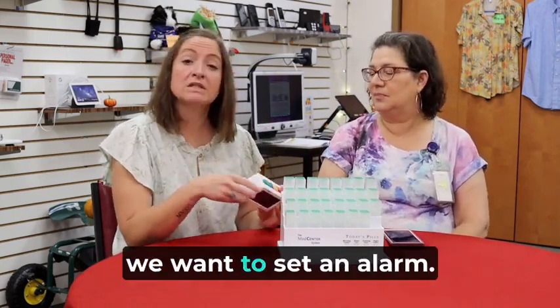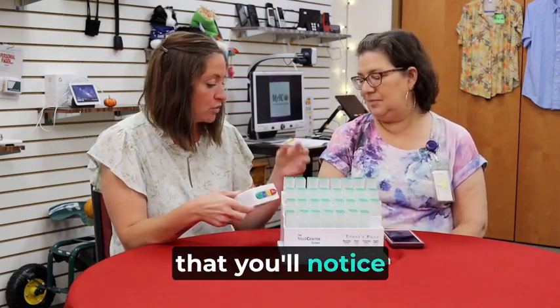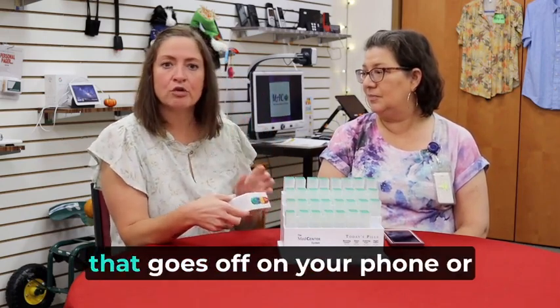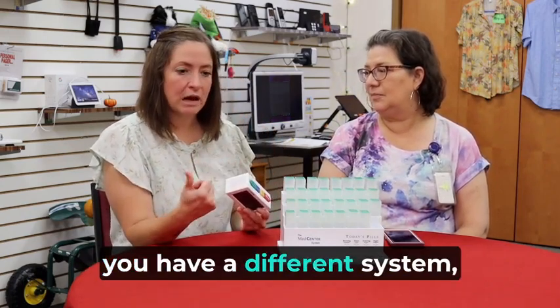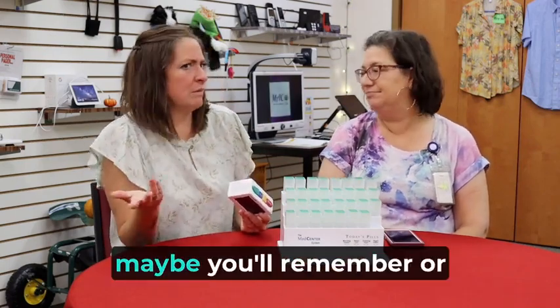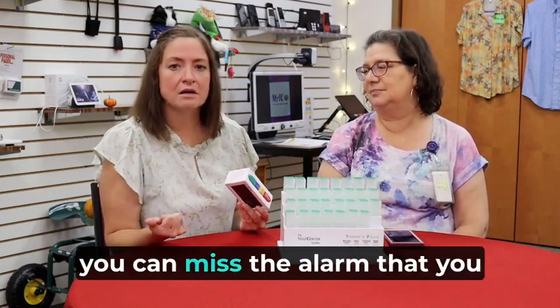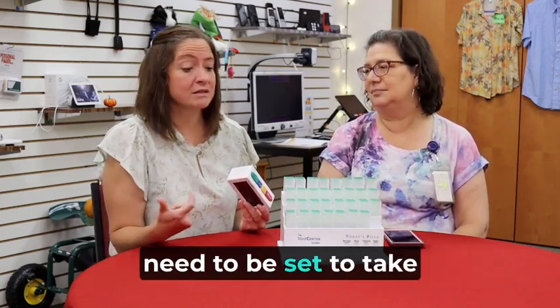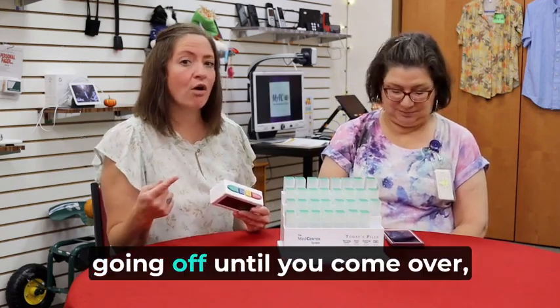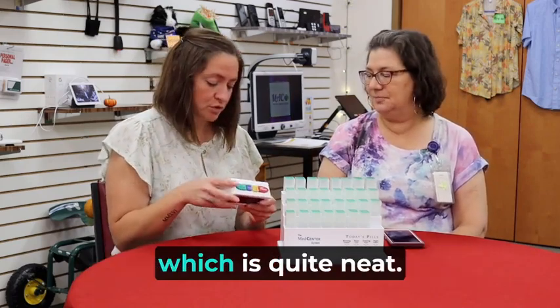But like we said, we want to set an alarm. And Sandra, the cool thing about this alarm that you'll notice when we set it, is that instead of an alarm that goes off on your phone or a different system, it'll ding and maybe you'll remember, or maybe you even heard it, but if you didn't, you can miss the alarm that you need to be set to take your medicine. So this is really neat, and we'll show you that it keeps going off until you come over, acknowledge it, and turn it off, which is quite neat.